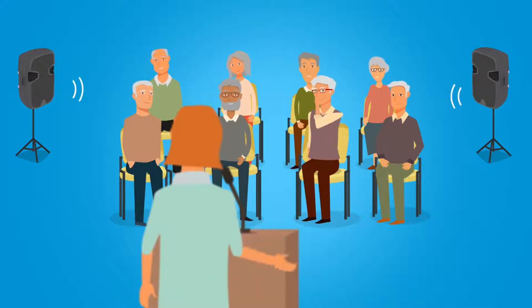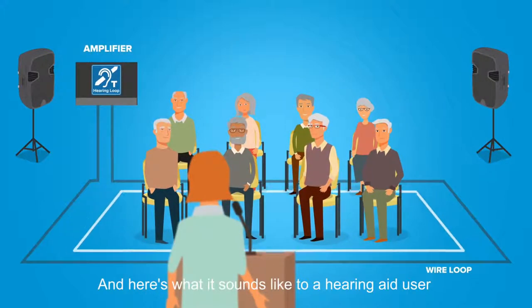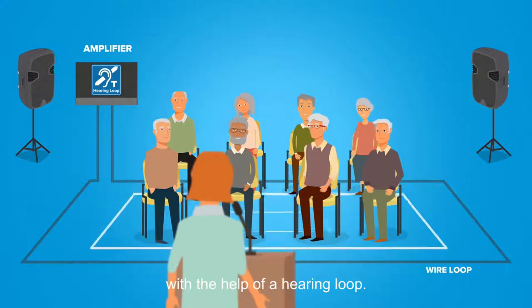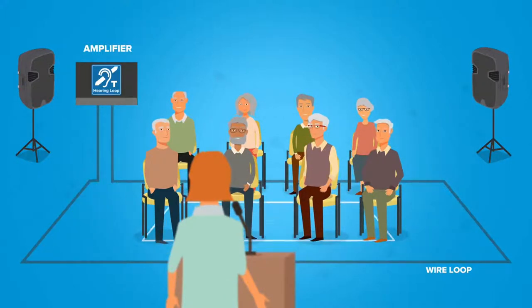Good morning, everyone. Today, we're offering the following activities. And here's what it sounds like to a hearing aid user with the help of a hearing loop. Good morning, everyone. Today, we're offering the following activities.